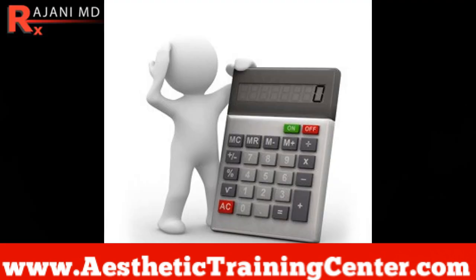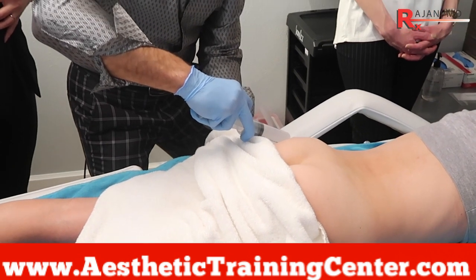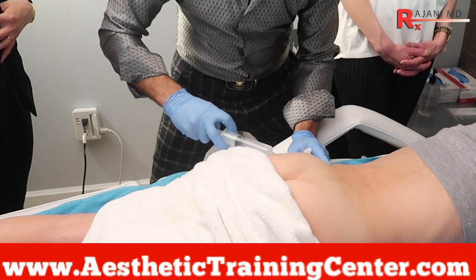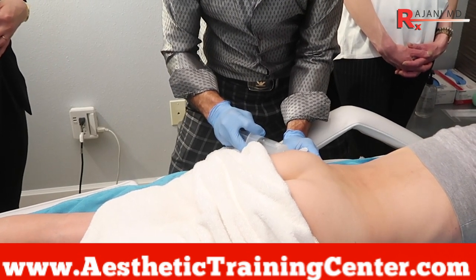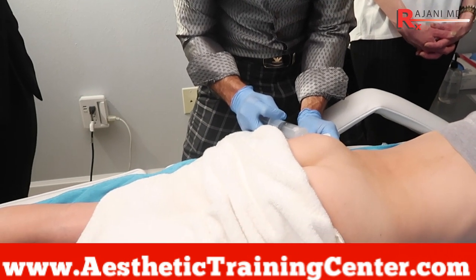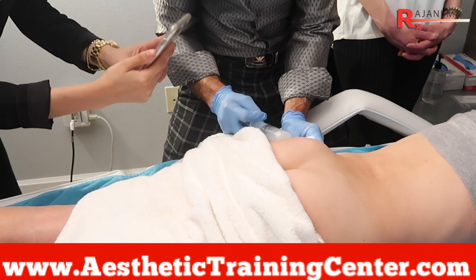Here I'm injecting again in the upper pole, watching the fill. You can get a reticulated pattern and that's normal — it often scares people initially. This is during a training session, so it's important to train on Sculptra for several hours. In this demo, all trainees can see what it should look like, what's normal, what would be abnormal, and most importantly what the big pitfalls are, because we want to do it safely.